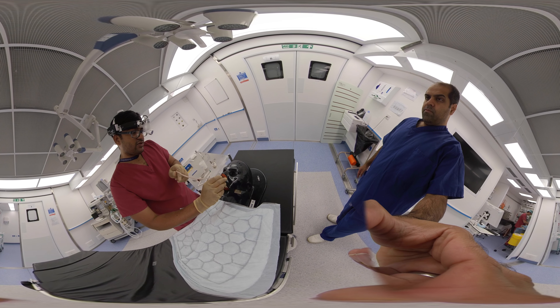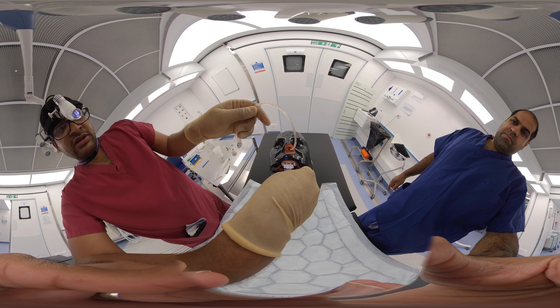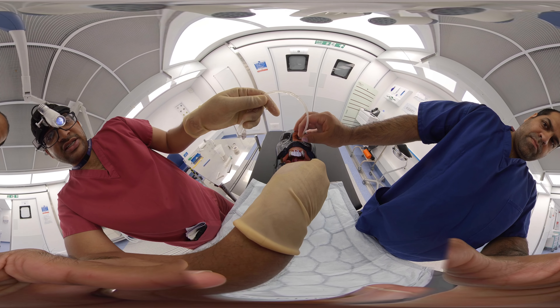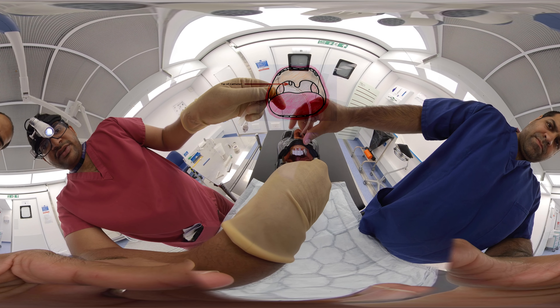While introducing the catheter, we should have a tongue depressor and ask the patient to open up. We depress the tongue and look into the posterior pharynx, and we keep introducing the Foley catheter until we get a view of the bulb.